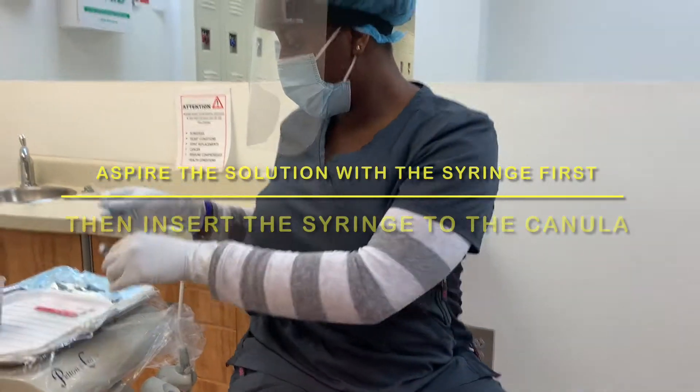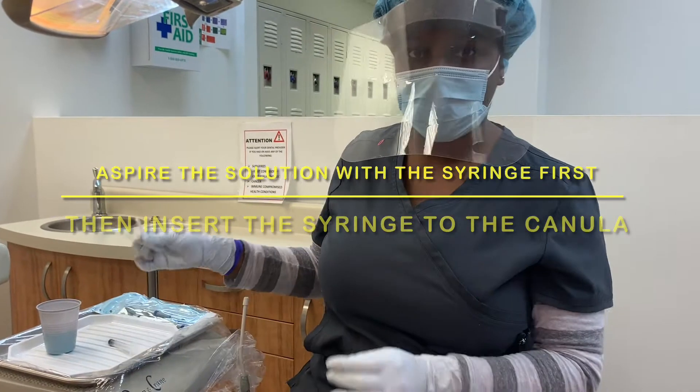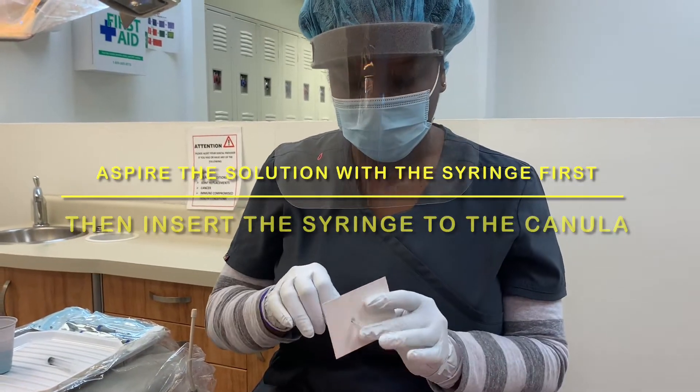It's not a needle — it's not going to poke you. So first, I'm going to insert the cannula in the protector sheet.